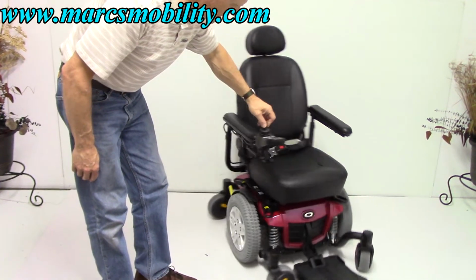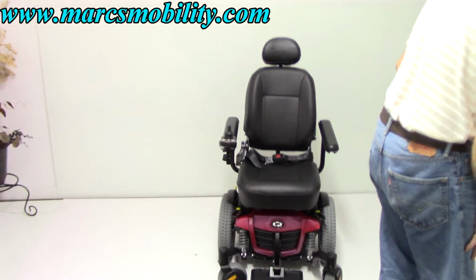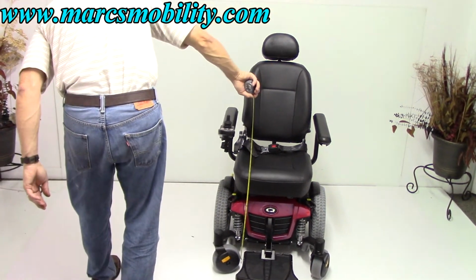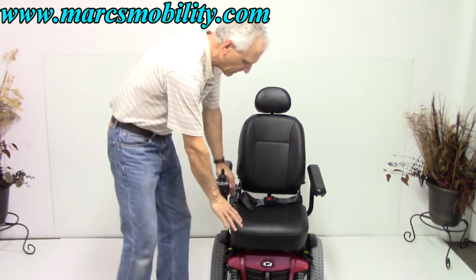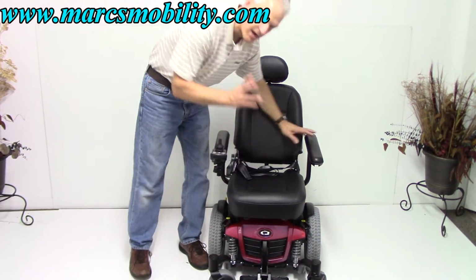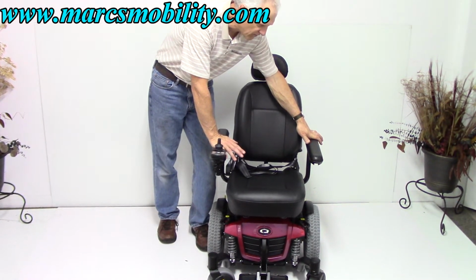The nice thing about this chair is that it's very low to the ground right now. Right now, the seat on this chair is probably from ground to top of the seat is 19.5 inches. So it's really low to the ground. It's a 16-inch by 18-inch seat. 16 by 18, so it's not a big seat. So this is probably a seat for a medium-sized person.